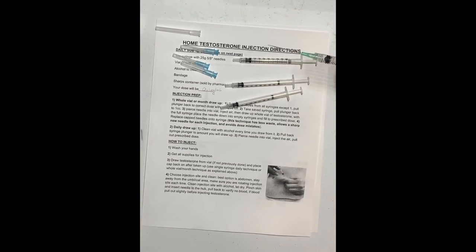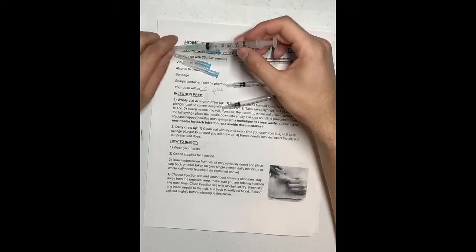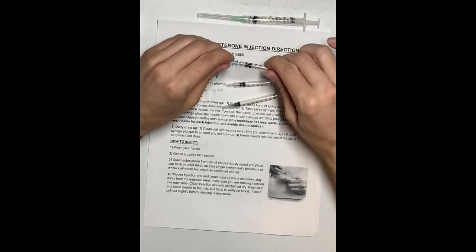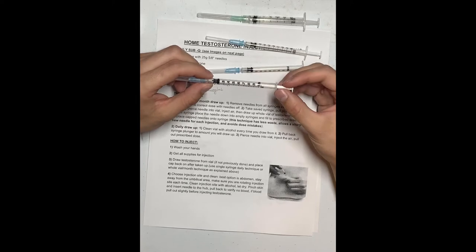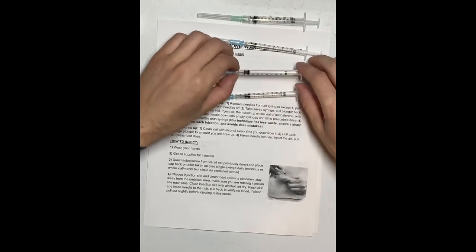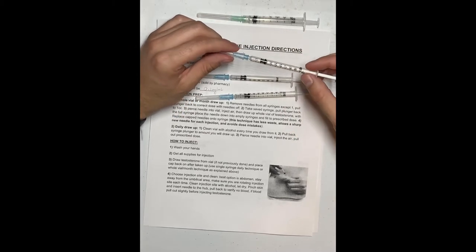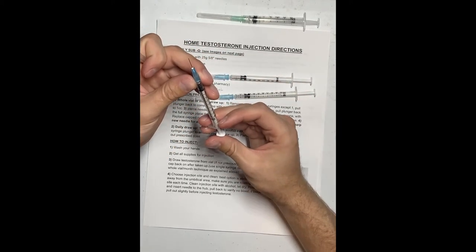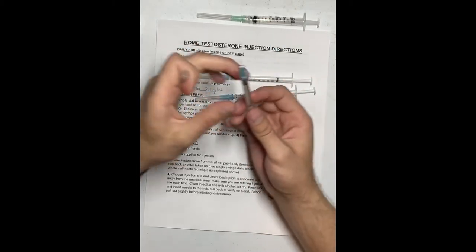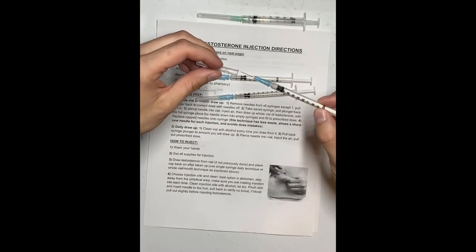Step four: replace the needle caps onto the syringes. I like to push the plunger back just a little bit so I don't accidentally push fluid out when transporting them. The important part is that when you get ready to inject, you move the plunger back up to the original dose of 0.1, and have a little bit of fluid come out of the needle so you know you won't inject yourself with air.